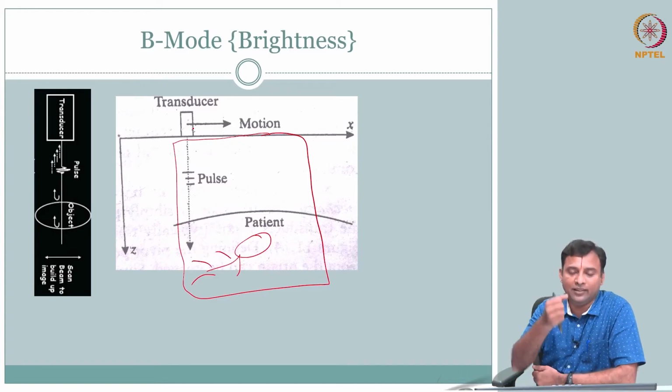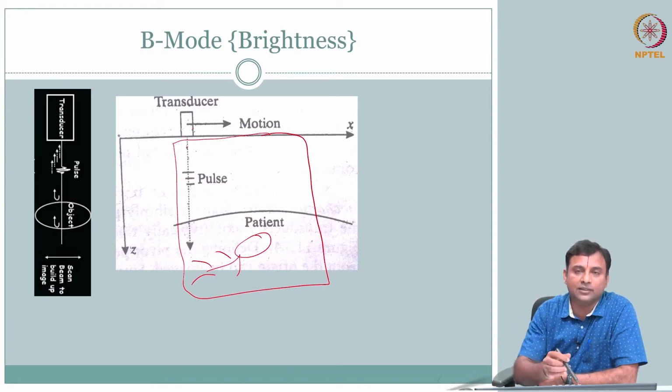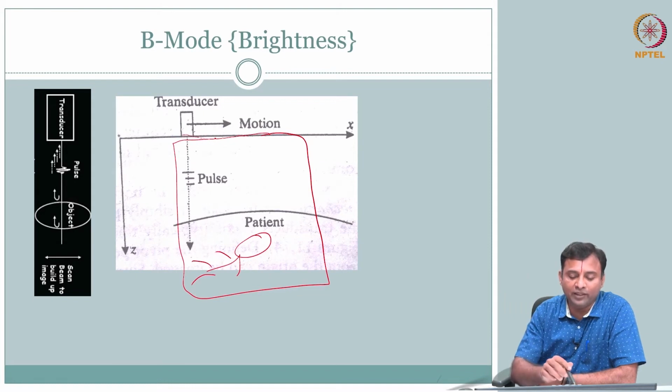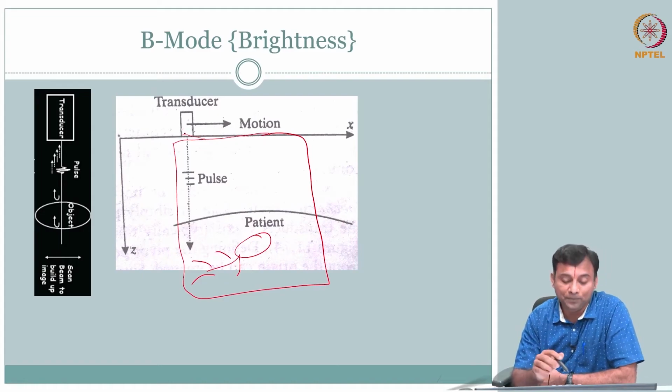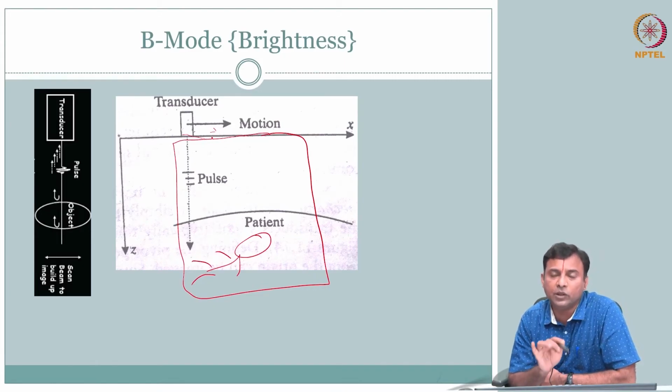Likewise you have a transducer that will be attached to an arm, and the doctor has to basically move it, but it is engineered such that it will move in a straight line at a certain velocity. So this is how they used to do it. That way it is registered, you can move, but you notice the challenge. So this is straightforward, we are not going to spend more time on this. This is how it started.